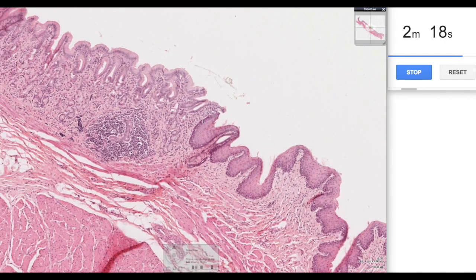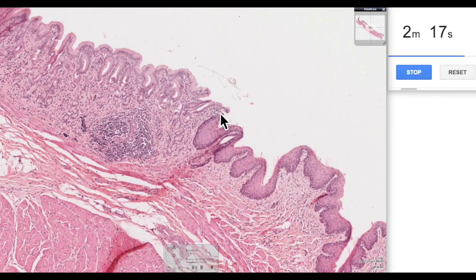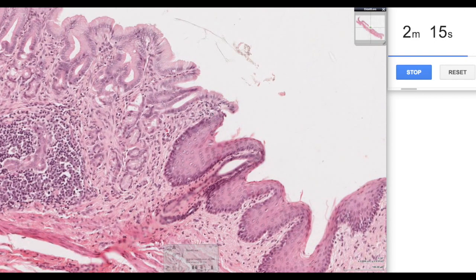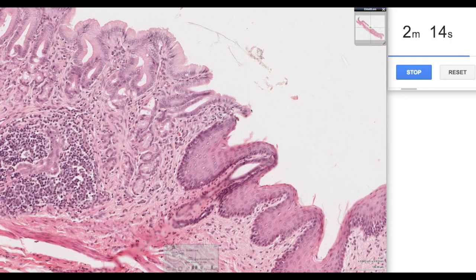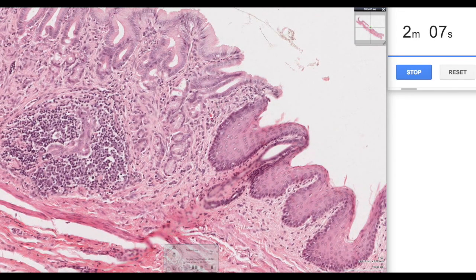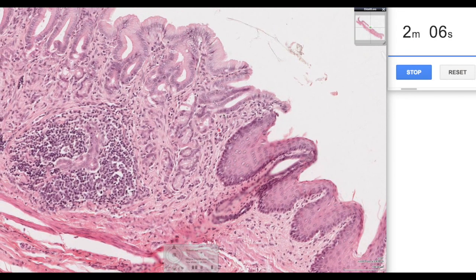If we move across, we have the region where we have a junction. Magnifying again, we've got these simple columnar cells which mark the beginning of the stomach. This first part of the stomach is a region known as the cardiac region of the stomach.